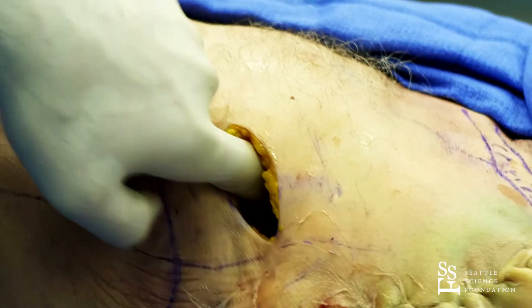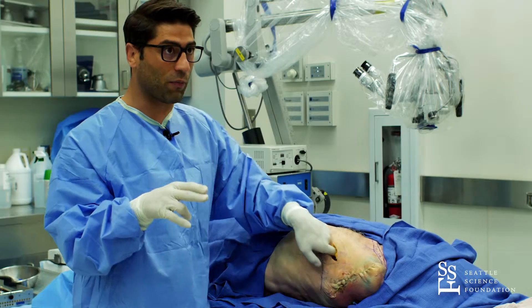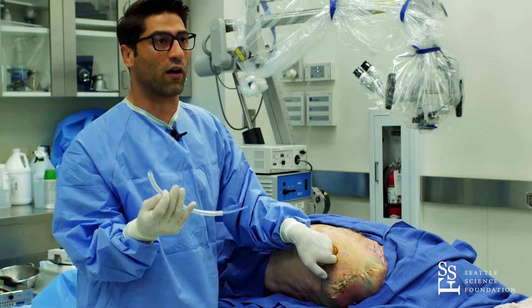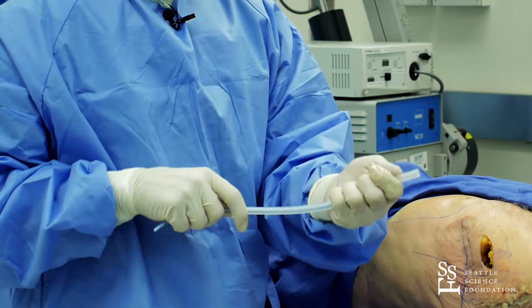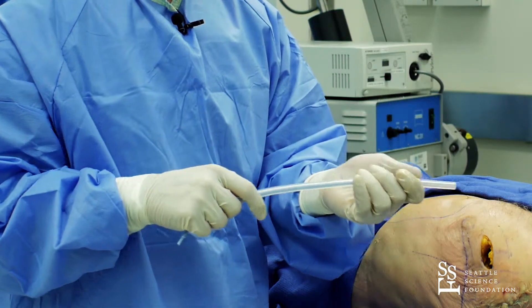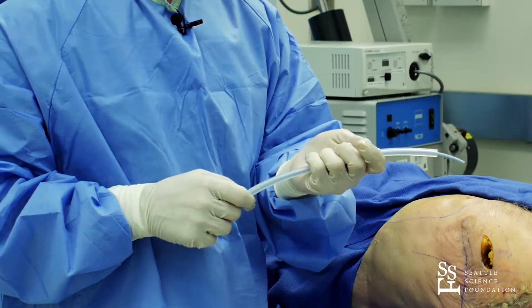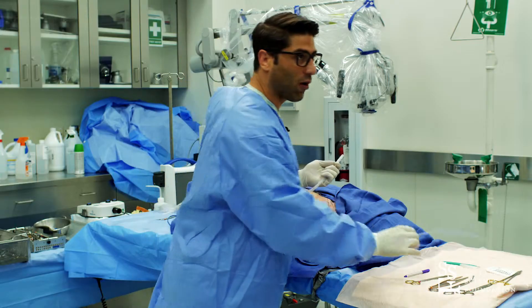A common mistake is not having enough space between the ribs, so the hole isn't big enough to put the chest tube in conveniently. The second mistake is putting in the chest tube with the trocar. Some people use the trocar like a joystick, which is okay, but it's very easy to slip and push the trocar in, injuring the lungs. That's why I always take the trocar off — I don't need it.